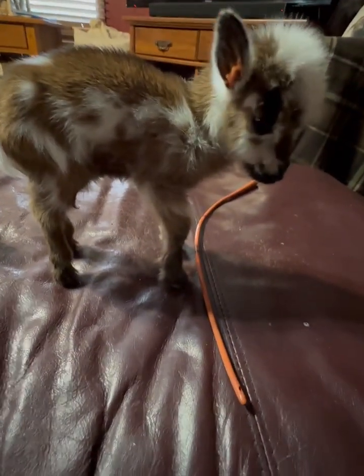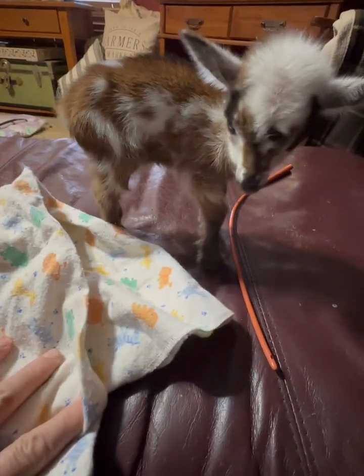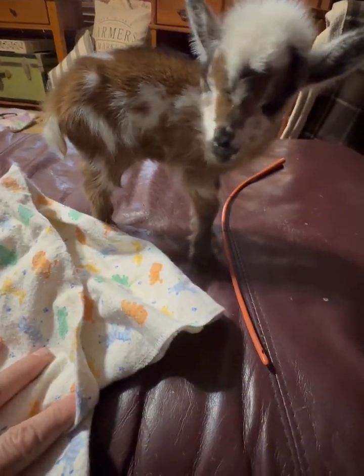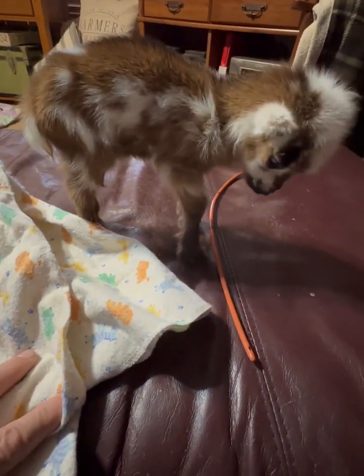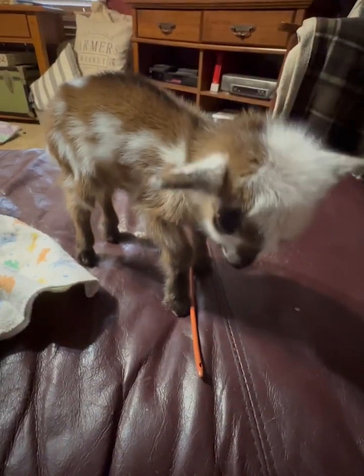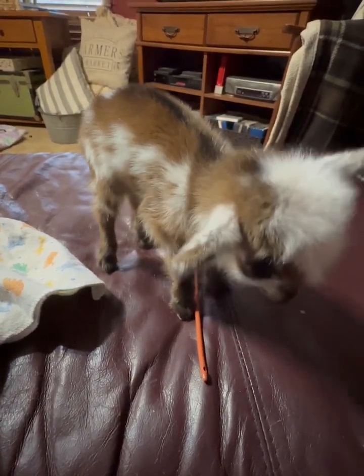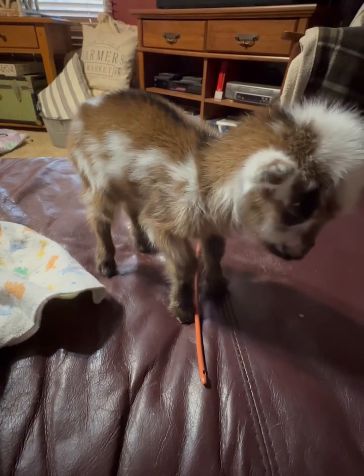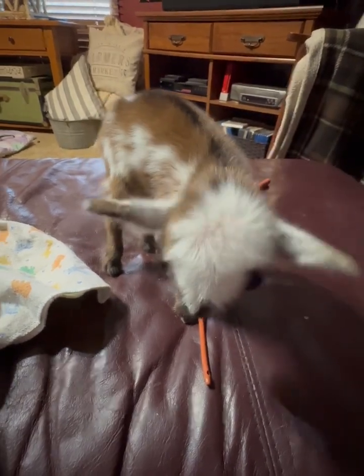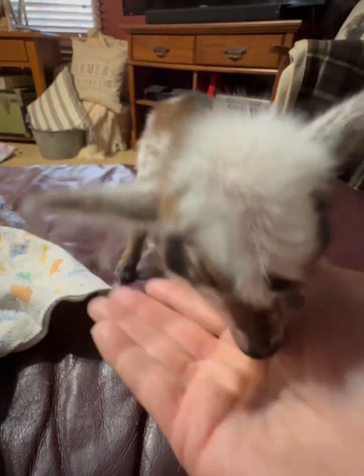I'm going to wrap him in this baby blanket and swaddle him so he cannot move. The reason for that is you don't want them to move. Of course they don't like being tube fed — just like you would not like a tube being put down your throat — and you don't want him to move.